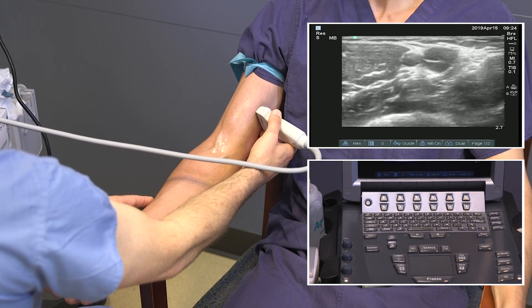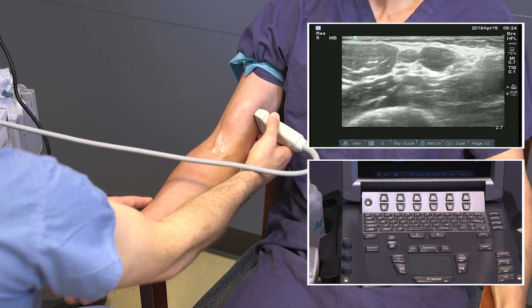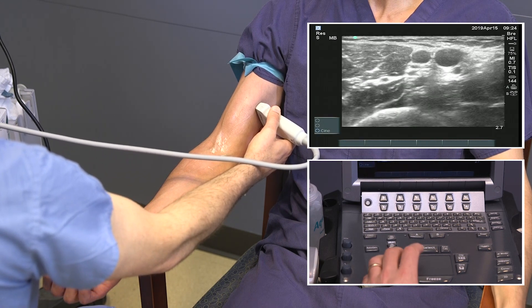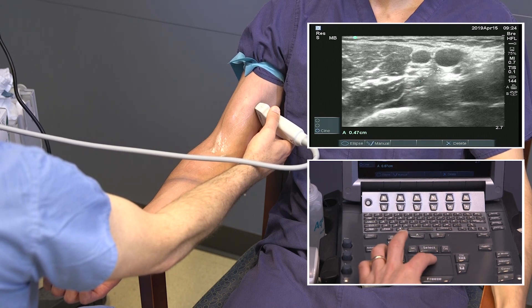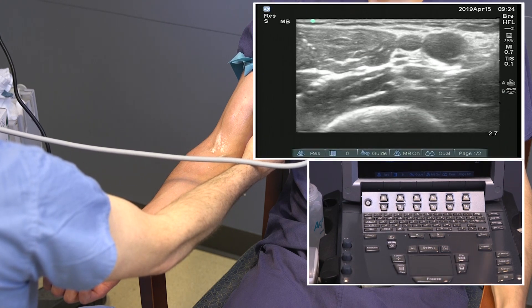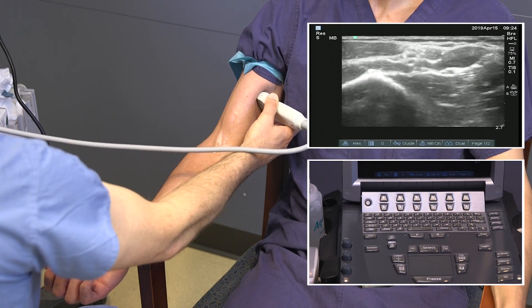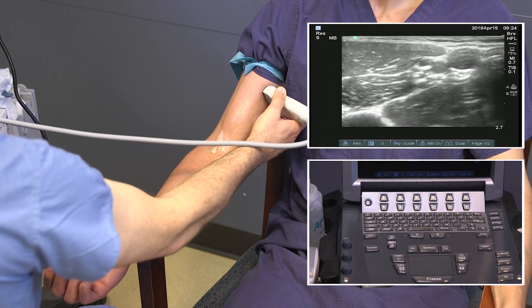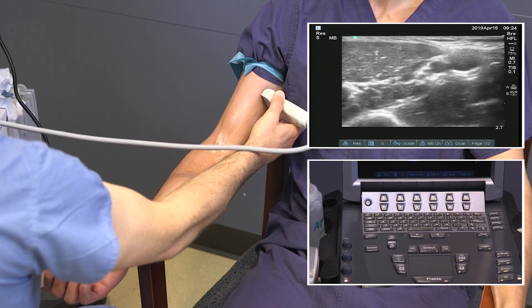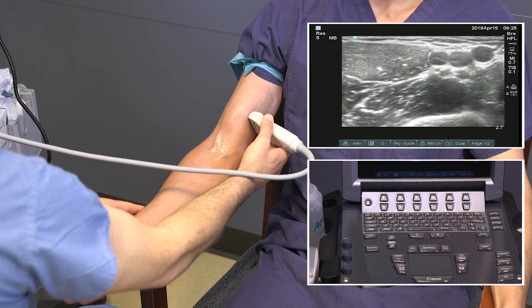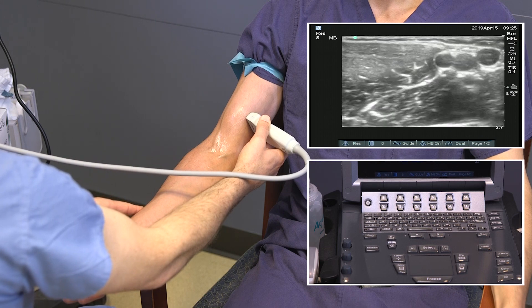For the arterial access, we want to think about where the artery is accessible and what the relationship is with the median nerve. The median nerve is seen just below the brachial artery. You see the small fascicles and then it rotates more laterally. It's important to identify the median nerve so we don't injure that during access.